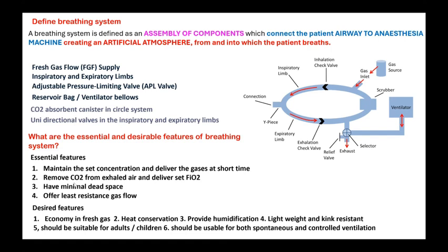And it should remove CO2 from exhaled air, either by expelling the entire exhaled air into the atmosphere or absorbing it with soda lime, and deliver a correct FiO2. So it should not dilute the delivered oxygen and make the patient hypoxemic. And it should have minimal dead space. Apparatus dead space should be minimal.